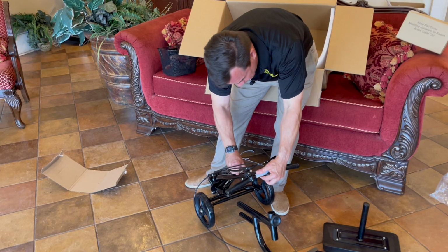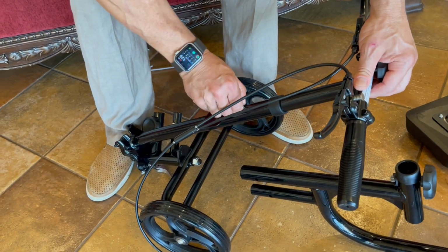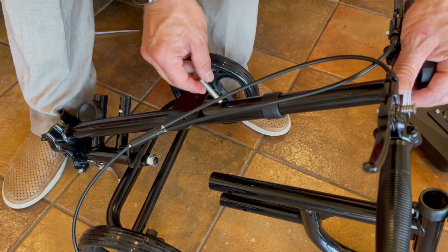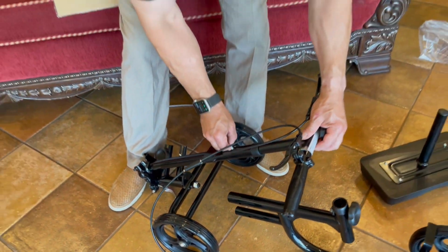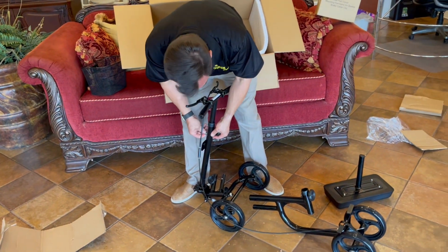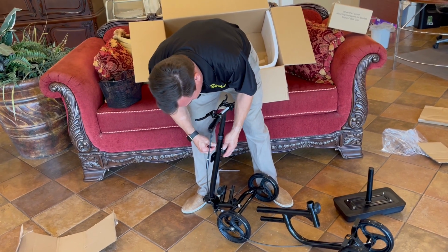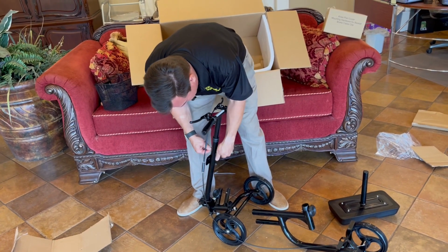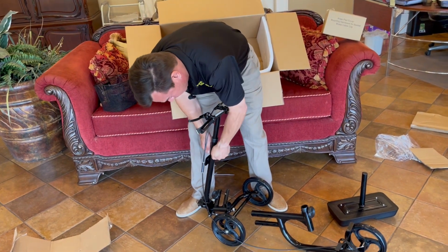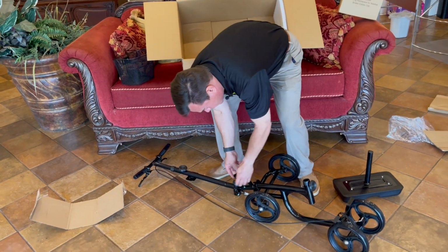The bolt in this particular case has a hexagonal head, and the hexagonal head of the bolt actually fits within a hexagonal shaped cutout on the steering column. For all these bolts, except for the one for the seat cover, or the seat, that is the case. So now we get this all nice and screwed down so that the handlebars are nice and tight and responsive, like so. And then we go to the next one.